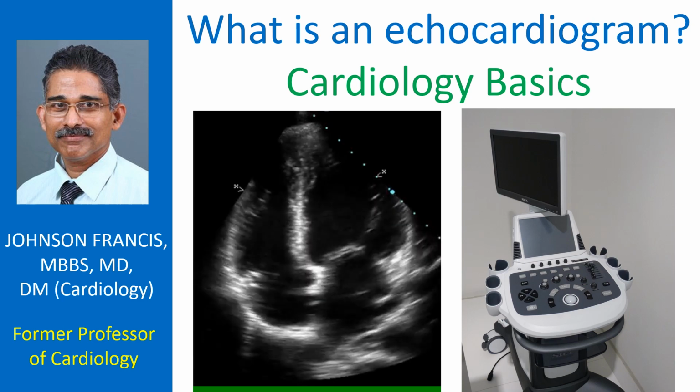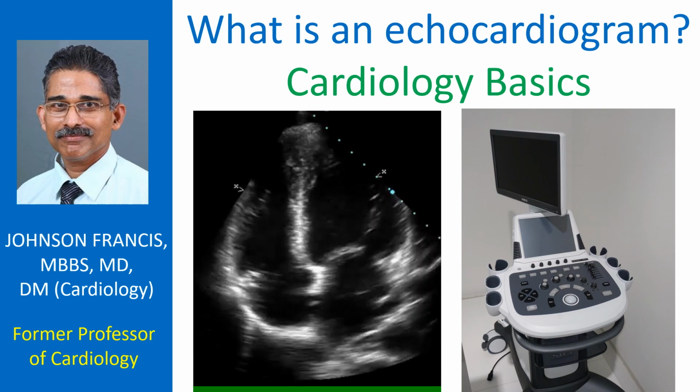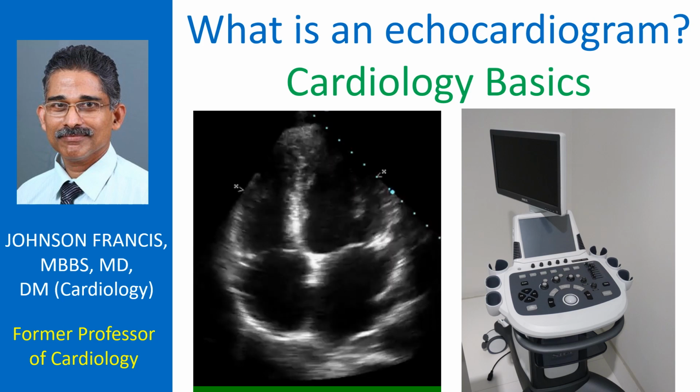Echocardiogram is ultrasound imaging of the heart. Ultrasound is high-frequency sound wave which is not audible to the human ear. The machine sends out ultrasound beams intermittently to the heart and listens for the echo.